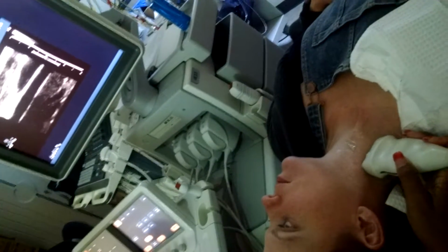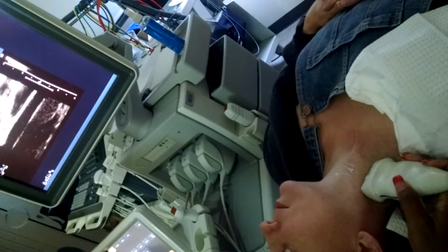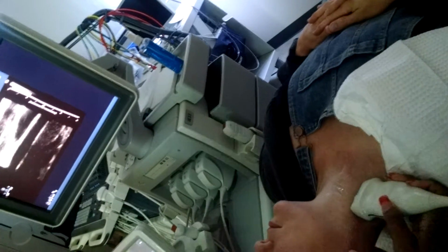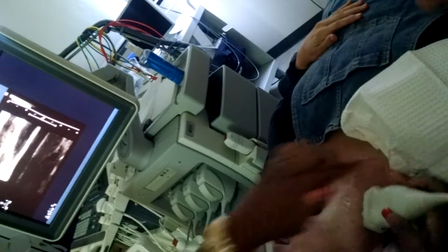When you were in partially transverse earlier, was the notch toward her left? Patient's right. Oh, okay. I thought you had it that way. This is her right. This is my right. I thought you did this way. Okay, sorry, I couldn't see.